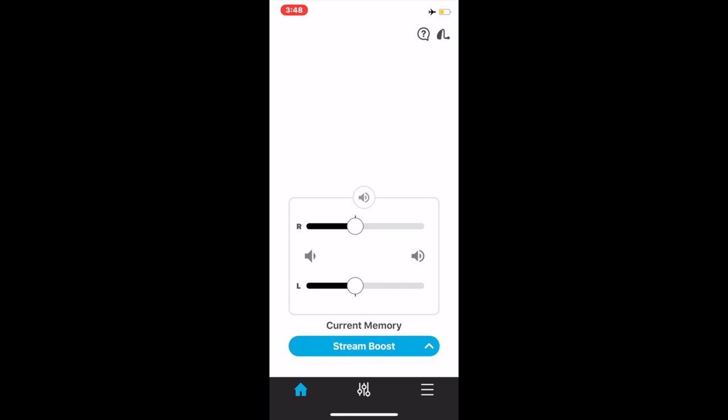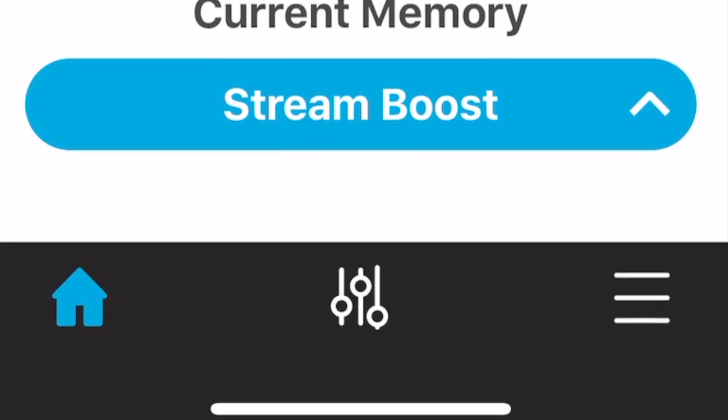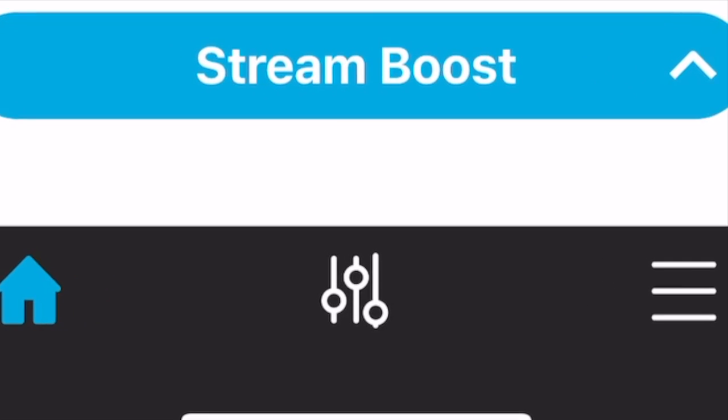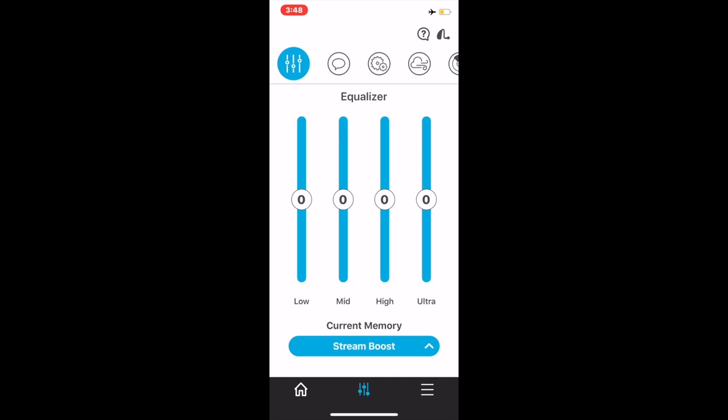Now, let's talk about other adjustments that you can make in the Thrive app. At the very bottom, in the center, is an equalizer icon. If you click on that, you will be given many more adjustments that you can make to the devices. The first one is the equalizer.